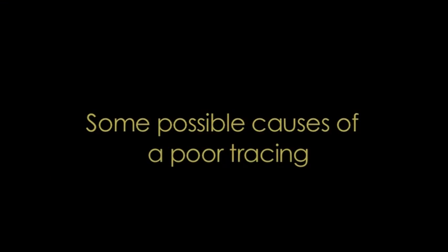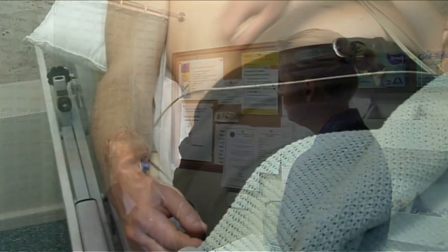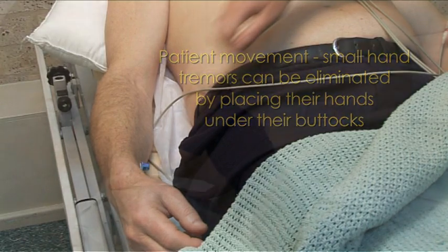It is essential to eliminate artifacts before recording the ECG. Poor technical recordings create blurred, fuzzy waveforms that are difficult to read and measure. Attention to the following details will ensure against artifacts and poor recordings.